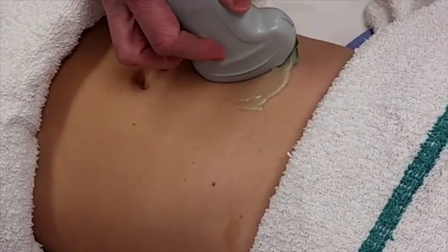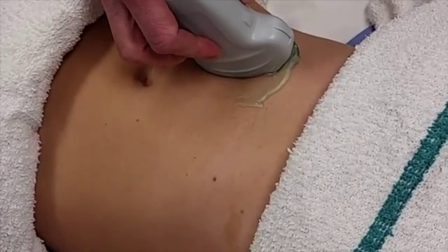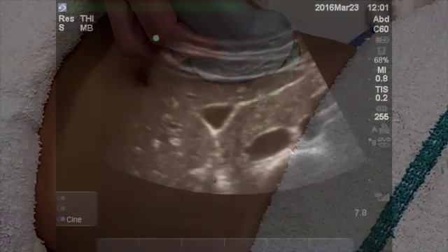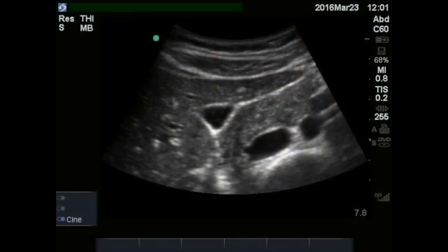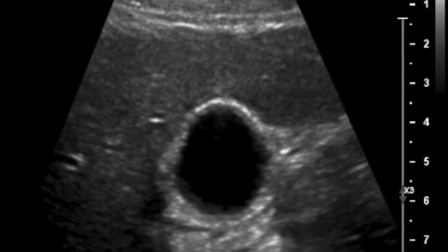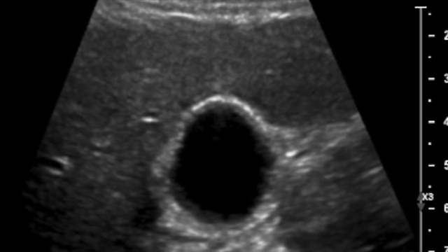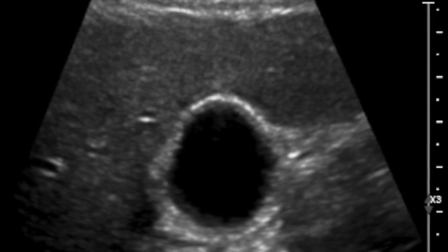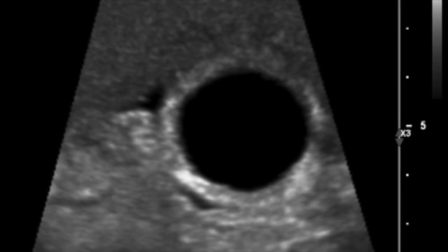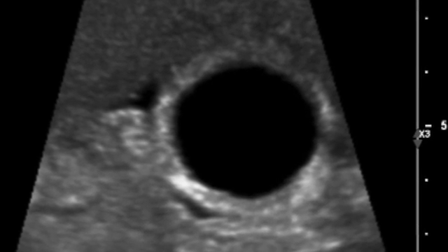If you want to look for wall thickening, rotate the probe to get the gallbladder in a transverse short axis view. The gallbladder wall should be thin, as if drawn by a pencil, less than 4 mm. If it looks like a thick line drawn by a marker, this is abnormal. You might also see pericholecystic fluid, which is always abnormal.